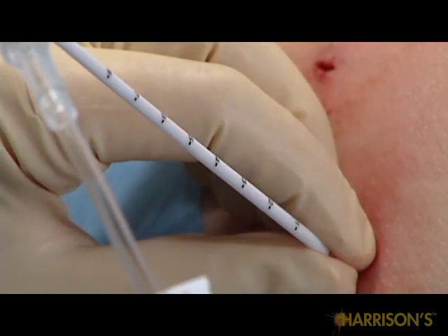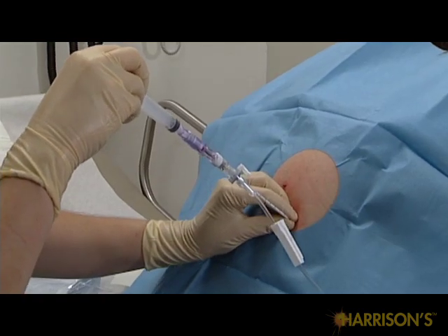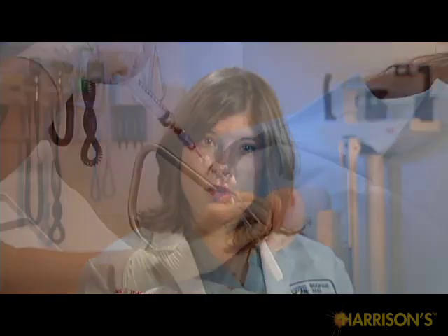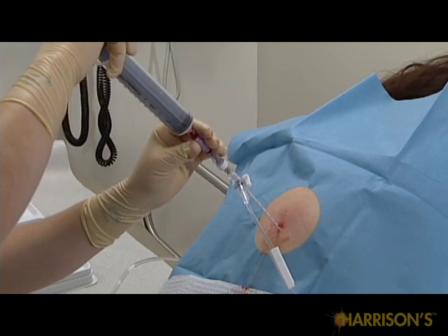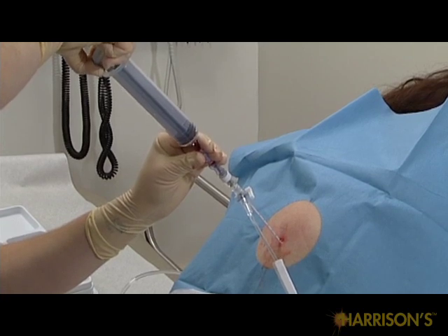Switch to the 18 gauge needle catheter and connect this to a fresh 10 cc syringe. Using the same tract you established for the pleural anesthetic, advance your 18 gauge slowly while drawing back on the syringe. Once fluid flows freely, trade the 10 cc syringe for a 30 or 60 cc syringe.